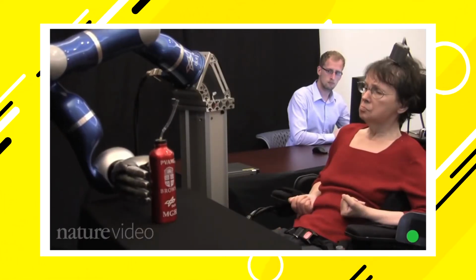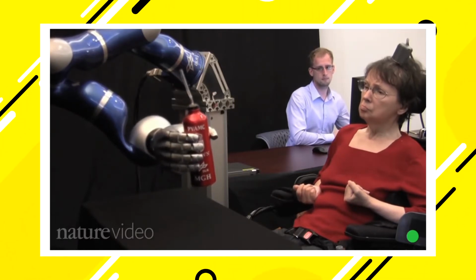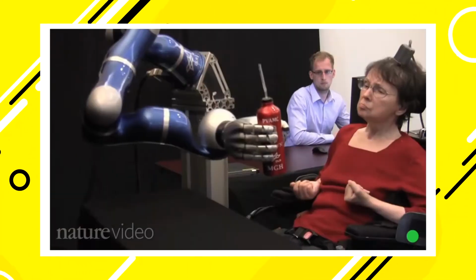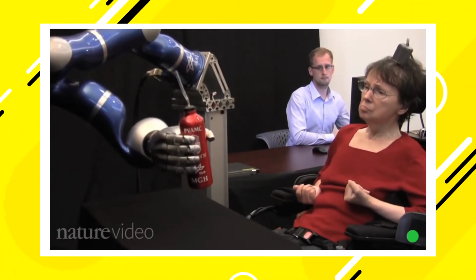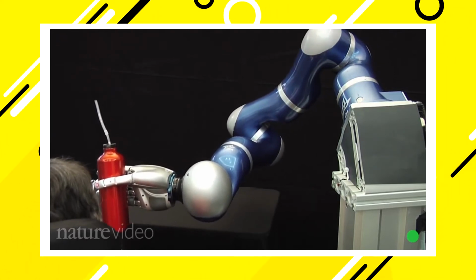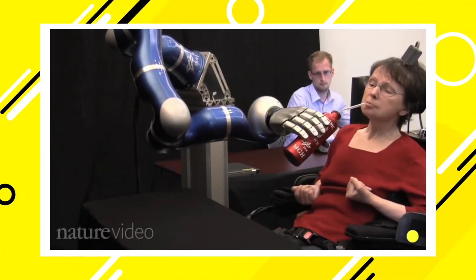You're watching the most advanced brain-machine interface in action. Kathy Hutchinson is paralysed and unable to speak, but just by thinking she's able to control the movements of this robotic arm and drink her morning coffee. She's part of a pioneering study run by researchers at Brown University in the US. Eventually, the researchers hope to build an arm that works as smoothly as a real one and can cope with more complicated tasks like brushing teeth. They'd also like to make a wireless version so the device doesn't need to be plugged directly into the patient's head. But for now, they're celebrating their progress with Kathy.